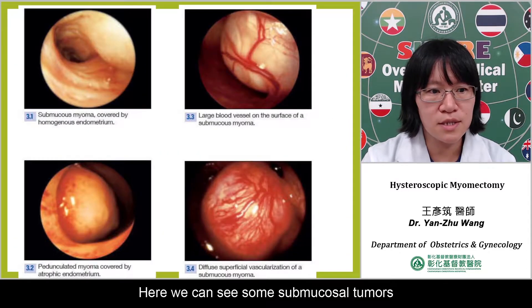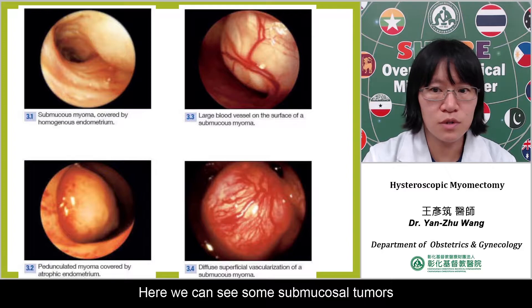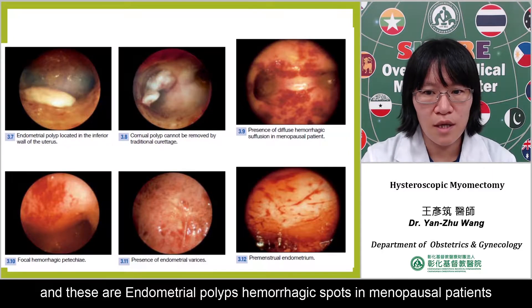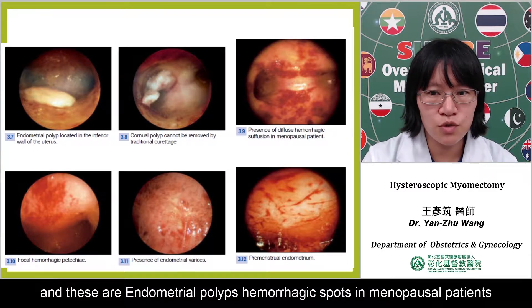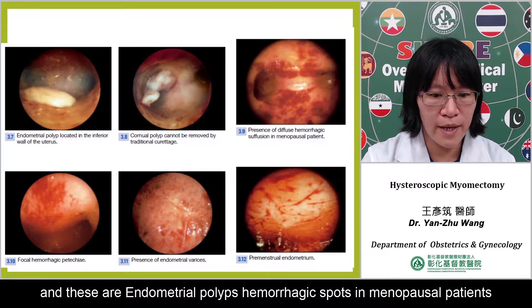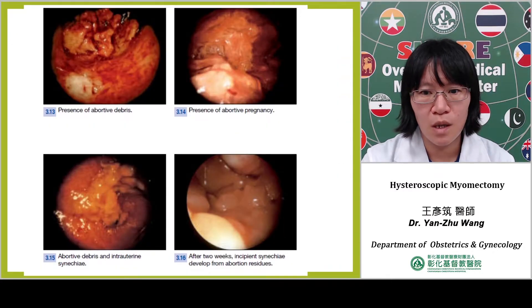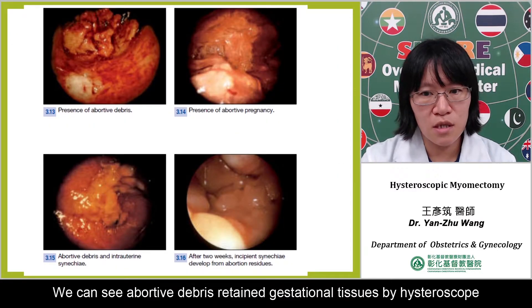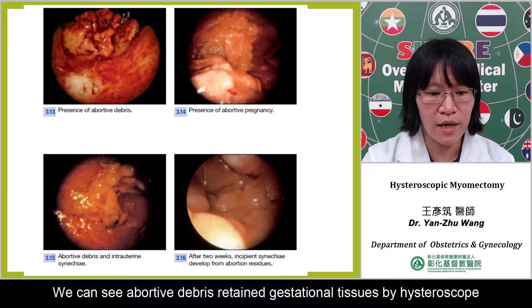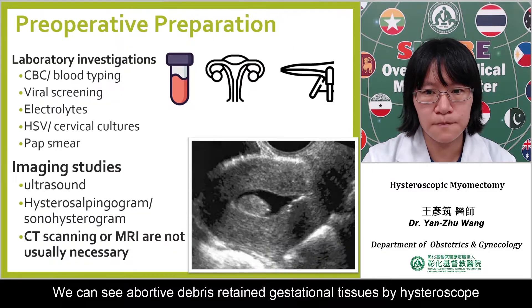These are some pictures of diagnostic hysteroscopy. Here we can see some submucosal tumors, endometrial polyps, and hemorrhagic spots in menopausal patients. We can also see abortive debris with tamped gestational tissues by hysteroscope.